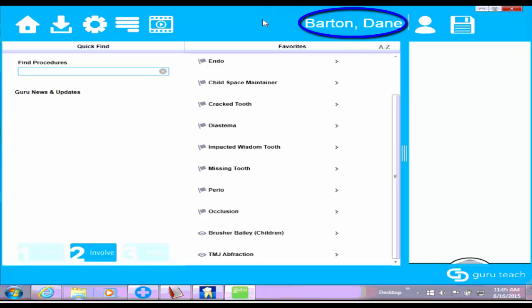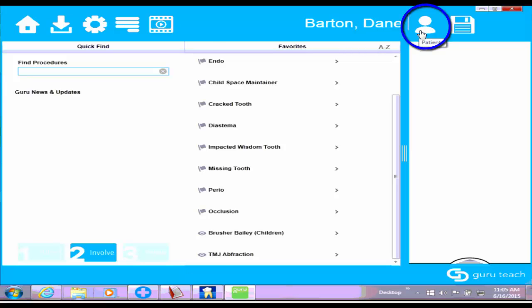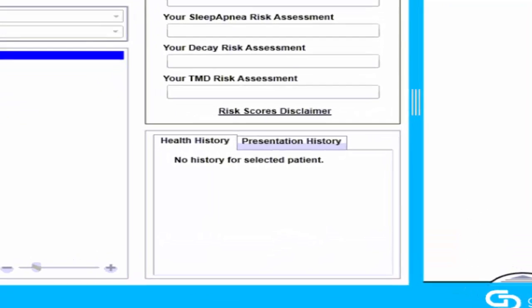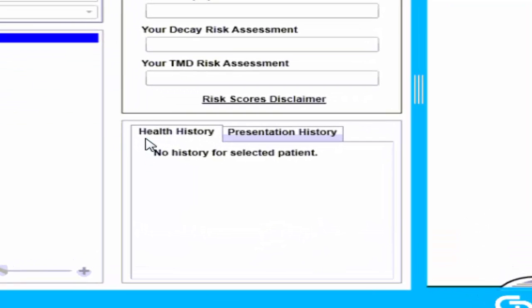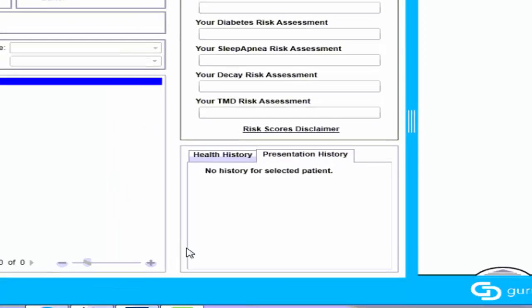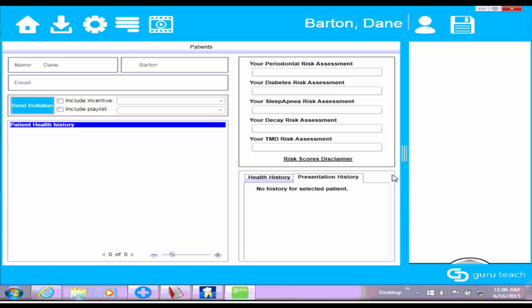To check if they have any history, I can click on the icon that looks like a person. That will open up the patient in Guru, and then I can click on either the health history or presentation history tabs down here at the bottom. It will tell me if they have any history in the Guru software. That's the first integration, if you want to check if they have history.